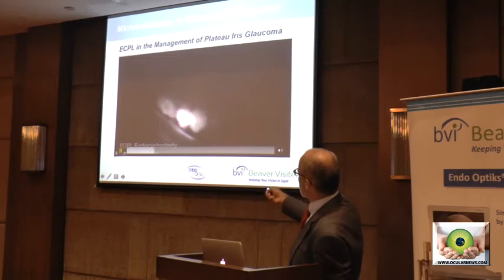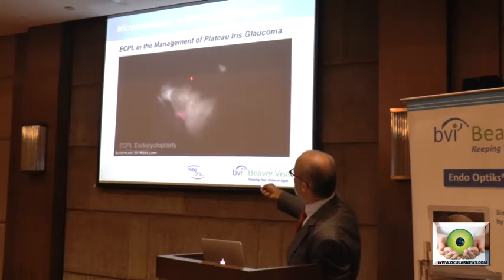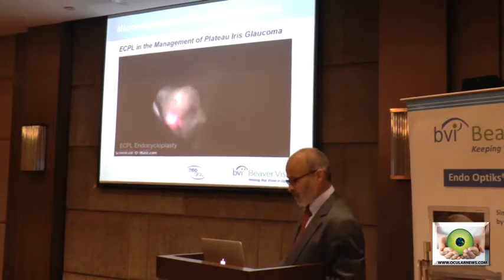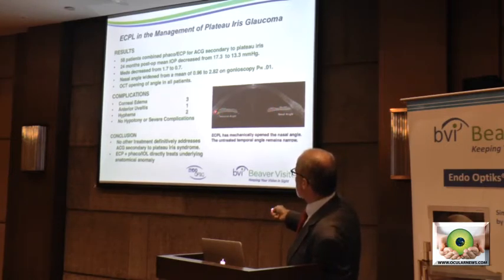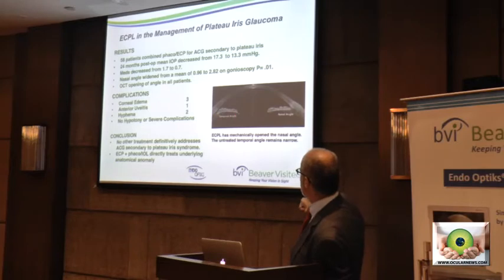And what he observed is when he treats, the processes rotate posteriorly, physically opening the space above them. So I'll show you the UBMs before and after. After the lensectomy, the iris flopped down nicely, but you can see in this untreated temporal angle here, there's been no change at all to the angle architecture. It's closed as it was before the surgery.